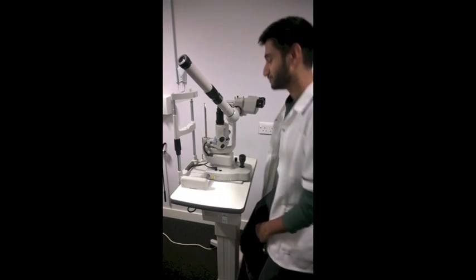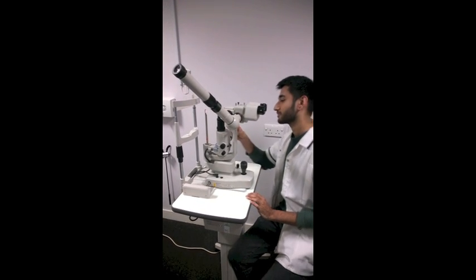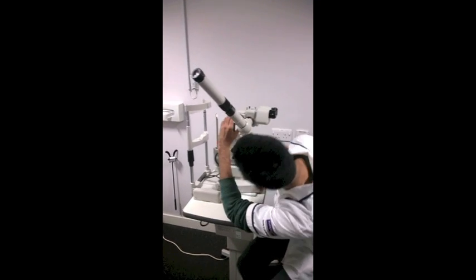The slit lamp should be set up in the usual way. The eyepieces must be focused at 40 mag and the PD should be adjusted to suit the practitioner.